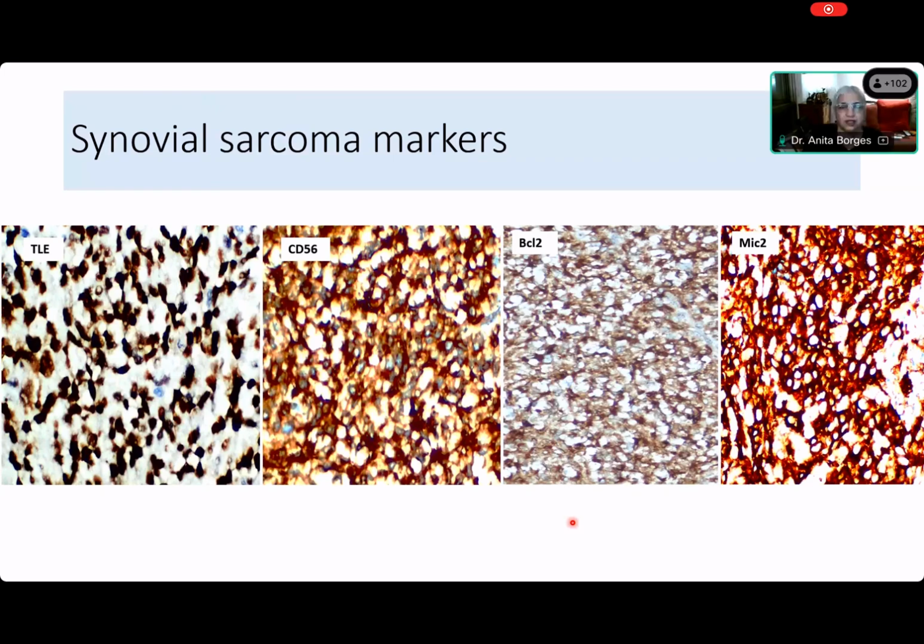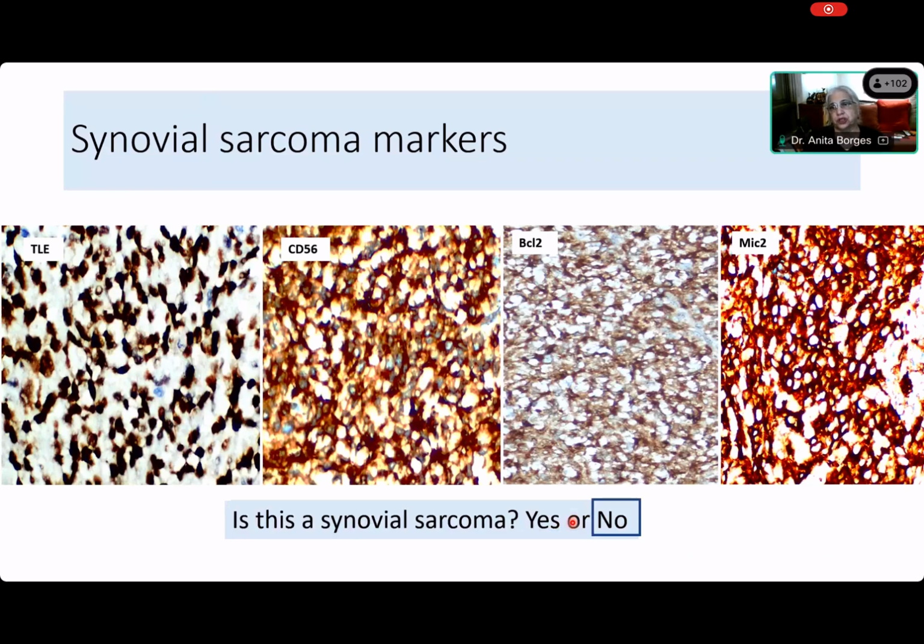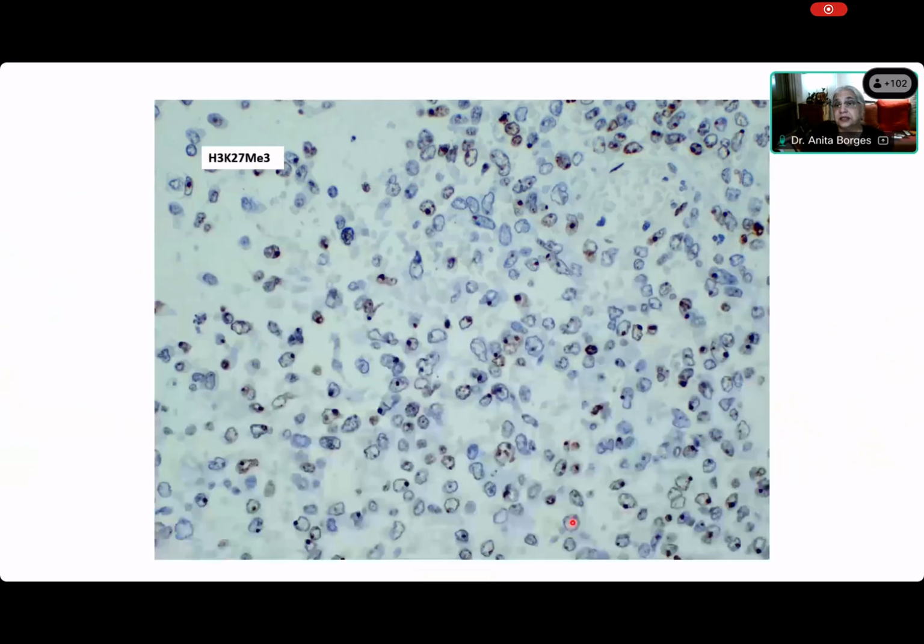The answer to this is no. It is not a synovial sarcoma. And what is the lesson that you learn? That you do not make a diagnosis on immunohistochemistry alone. All right? You do not. There are some good reasons for not calling this a synovial sarcoma. It has necrosis. It has mitosis. And this tumor, so we have to know why. And I told you that. All right? But we did something else as well.